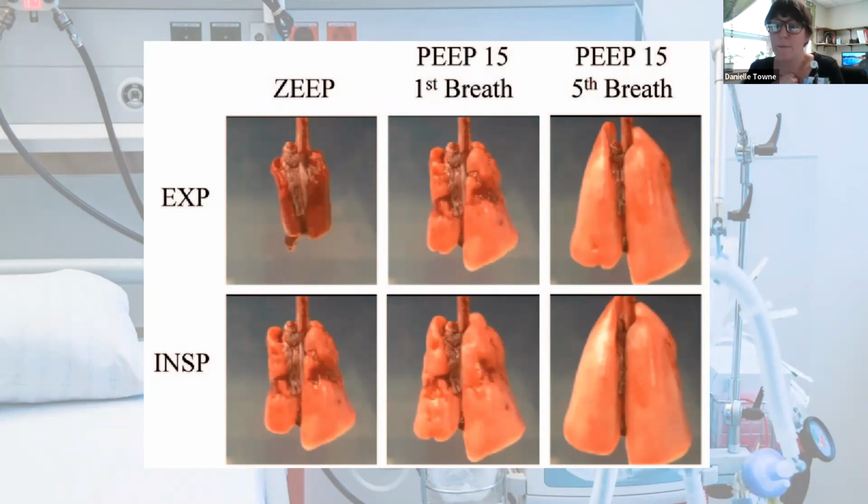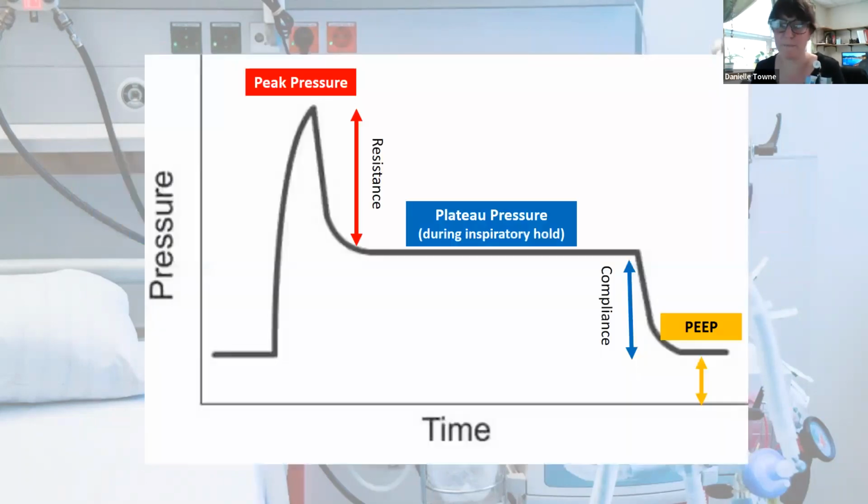in adults. Now keep in mind that the PEEP we set will contribute to their overall peak inspiratory pressure. So if our PIP, our peak inspiratory pressure, is 35, and we increase our PEEP by 5, our PIP will also increase by 5. What is our PIP? Okay, peak inspiratory pressure. The peak inspiratory pressure isn't something that you set on the ventilator. It's an indicator of the overall lung function.